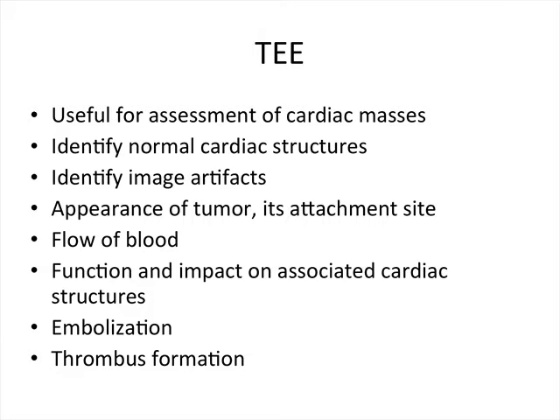TEE is helpful in detecting regurgitation or stenosis of valvular structures due to the presence of the tumor near or through the leaflets. In addition, the impact of the tumor on the function of associated cardiac chambers can be evaluated with TEE. Importantly, tumor embolization and thrombus formation are able to be assessed with TEE as well.